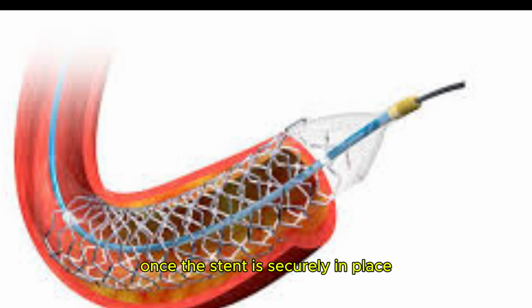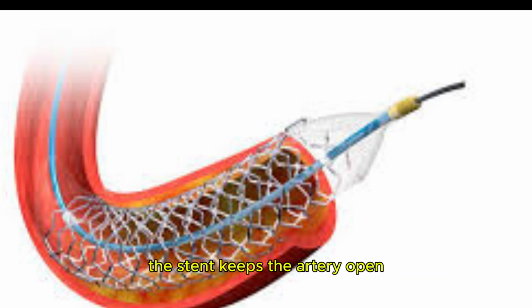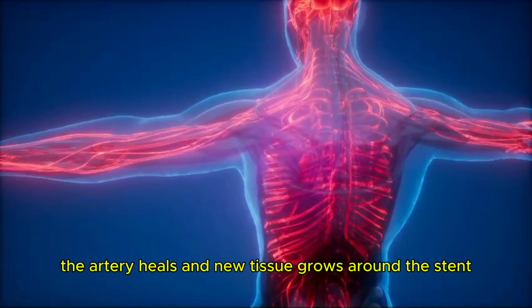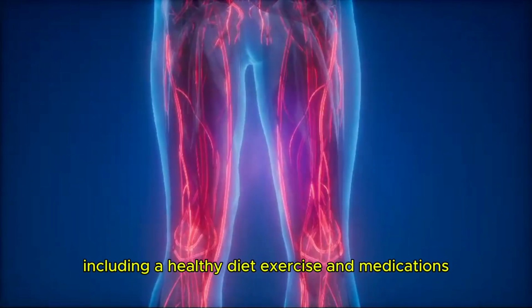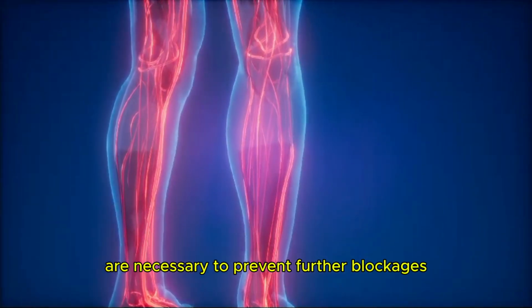Once the stent is securely in place, the balloon and catheter are removed, leaving the stent to keep the artery open permanently. The stent keeps the artery open, allowing blood to flow freely. Over time, the artery heals, and new tissue grows around the stent. However, lifestyle changes, including a healthy diet, exercise, and medications, are necessary to prevent further blockages.